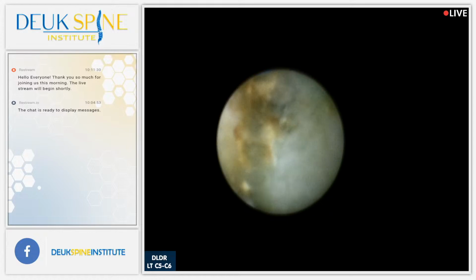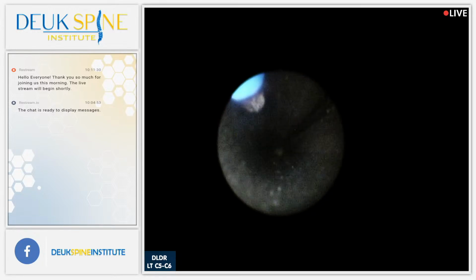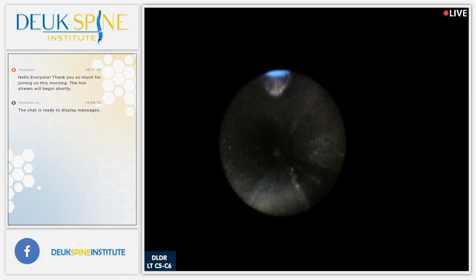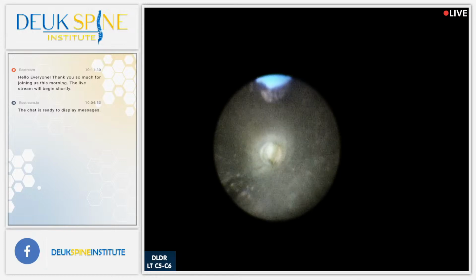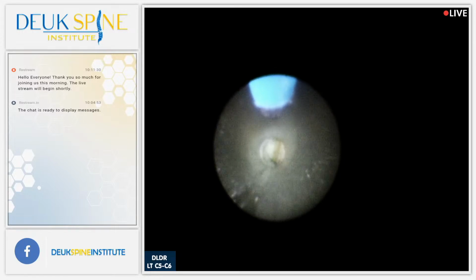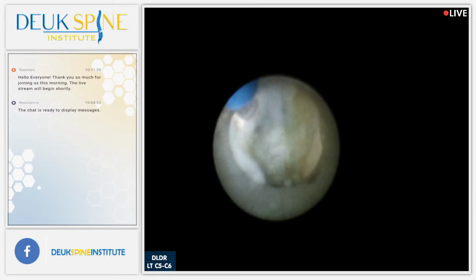And I was telling him that with this laser configured this way that we use it, we're able to basically ablate tissue, which is really what surgery is about, right? It's about removing things that shouldn't be there and repairing things sometimes. That's why they're called ectomies. Yeah, you're right.